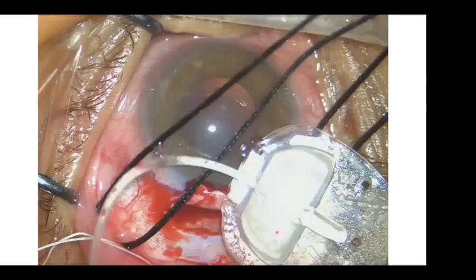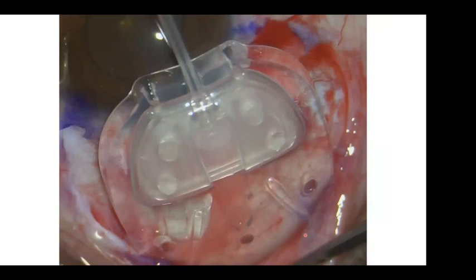Then I do priming, as you know, by injection through the valve. We do not inject vigorously; you can damage the membranes. Gently, once you see the fluid coming, that's enough. And then the implant should go smoothly.